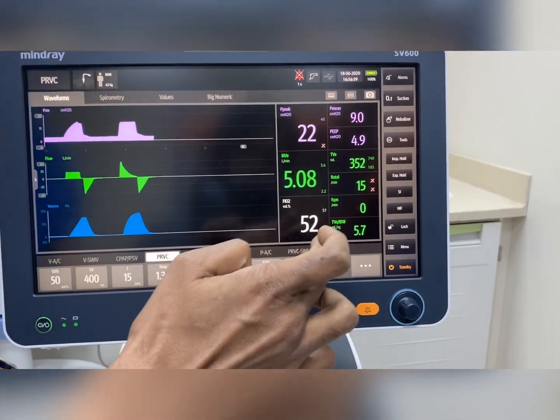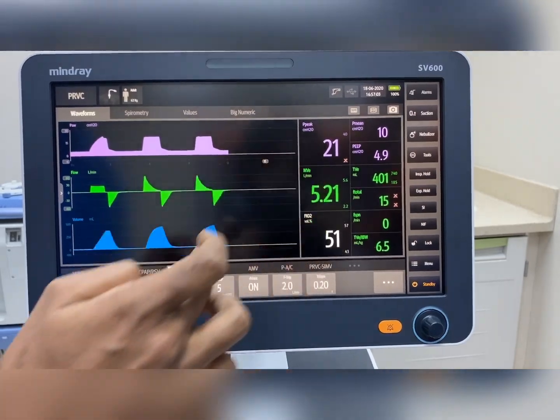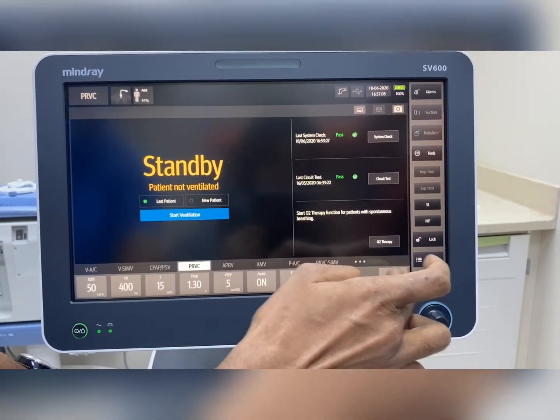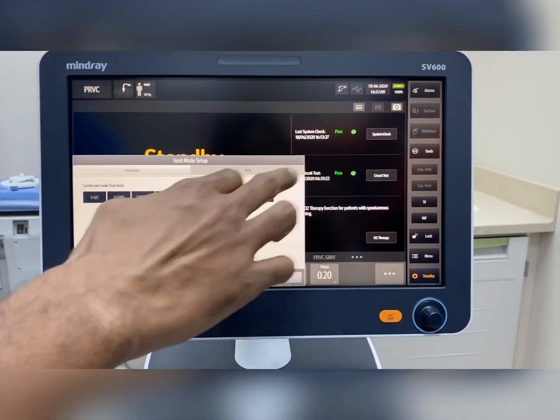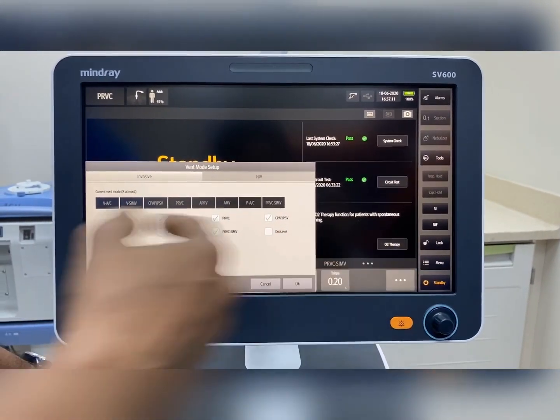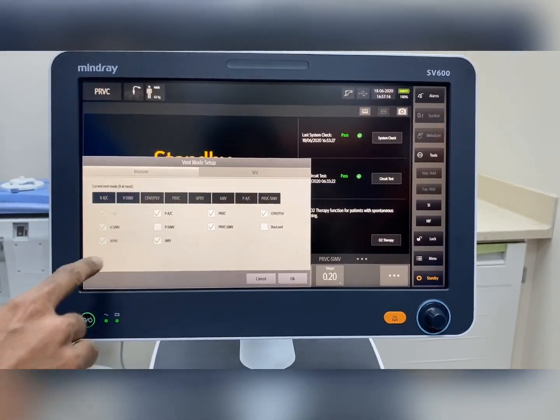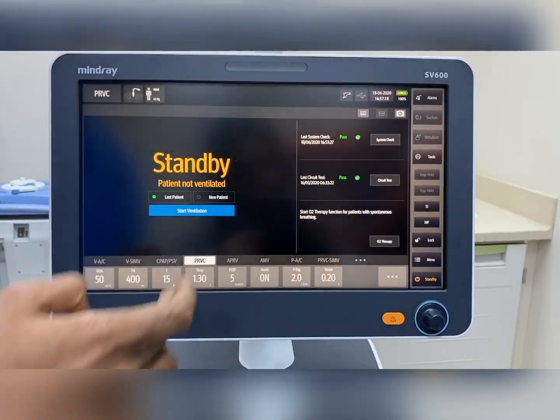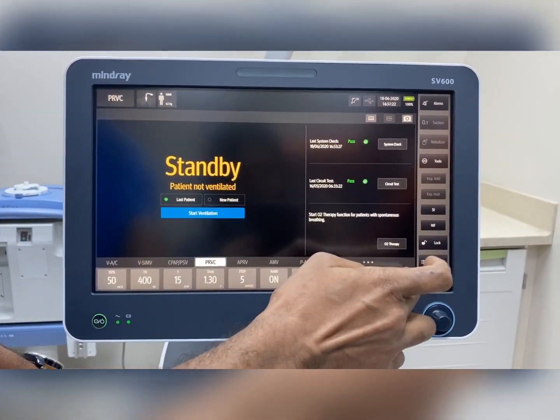All the settings can be seen here. There is a special option in the ventilator where you can add mode options — up to eight modes can be added to the screen. Additional modes are available; if you choose one and press okay, those modes will be added to the screen. The manipulation is easy.